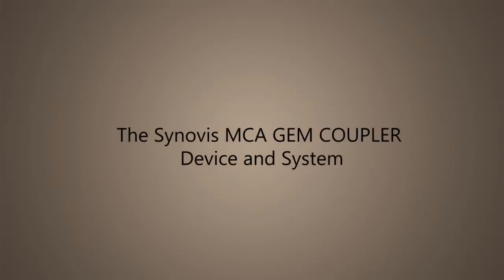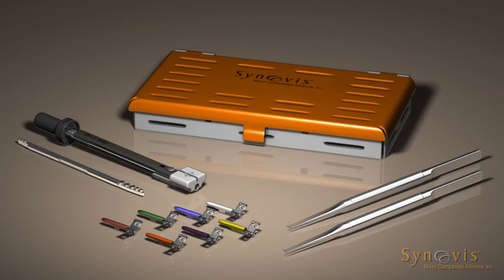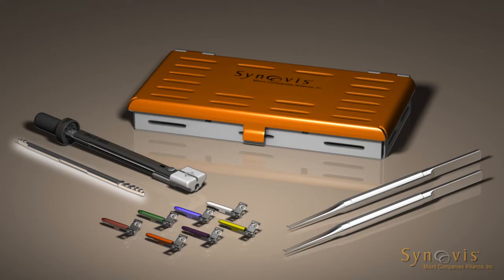The Synovis MCA GEM Coupler Device and System. The GEM microvascular anastomotic coupler rings are made of high-density polyethylene and surgical-grade stainless steel pins. The coupler system consists of a reusable anastomotic instrument, reusable coupler forceps, a sterilization tray, and a vessel measuring gauge. The coupler system is available as a complete system or as single items.